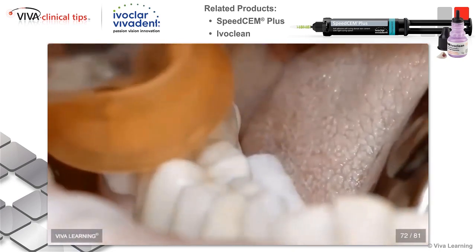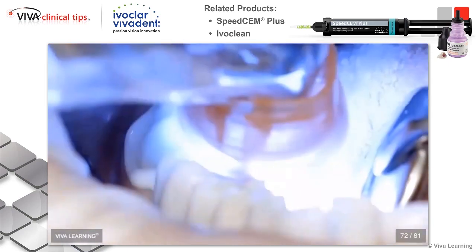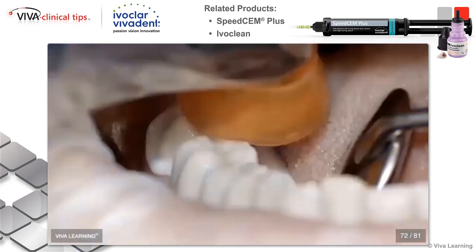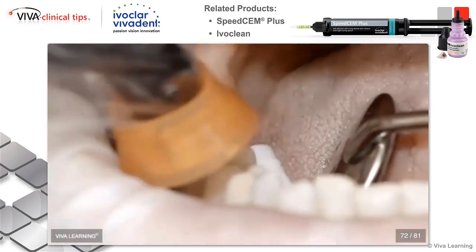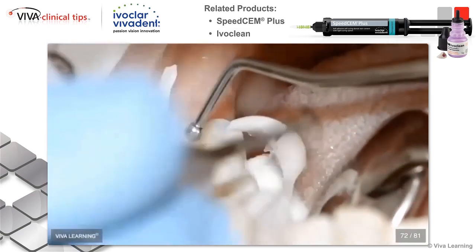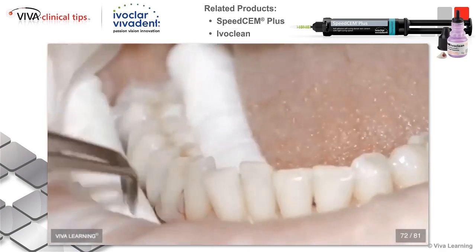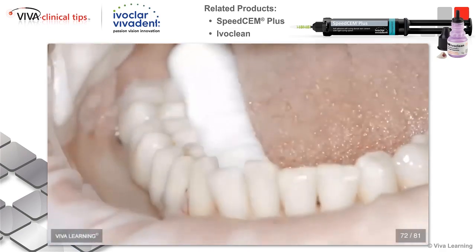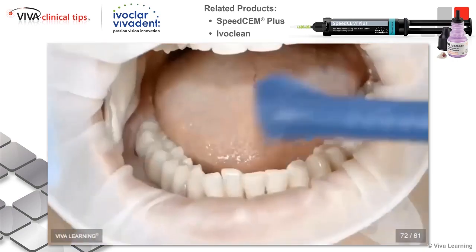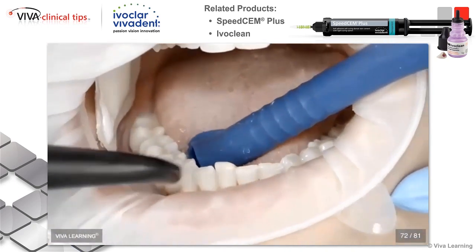So we're going to cure for 1 second at each of the quarter line angles. So on the molar is going to be 2 on the buccal and 2 on the lingual, and then we'll move forward to the bicuspid and do that same 1 second tack cure at each of the quarters as well. And you can see with that 1 second, the SpeedCEM Plus has a nice gel state and it peels right off from around the tooth. And because SpeedCEM Plus is a resin cement and has an air inhibited layer, we're going to place the liquid strip glycerin gel around there and do our final cure of 20 seconds per surface with the liquid strip glycerin gel in place.